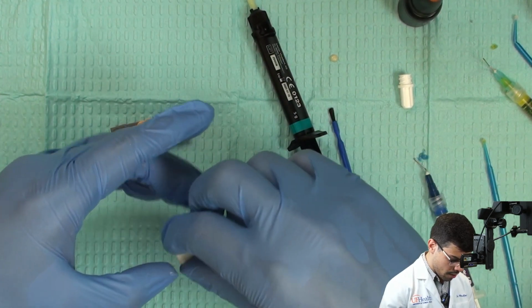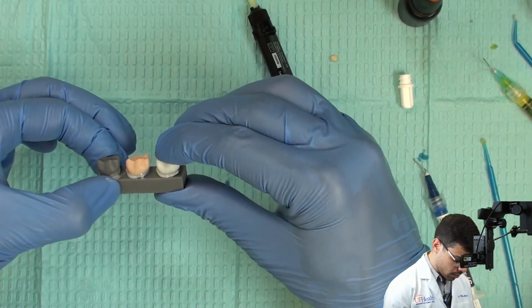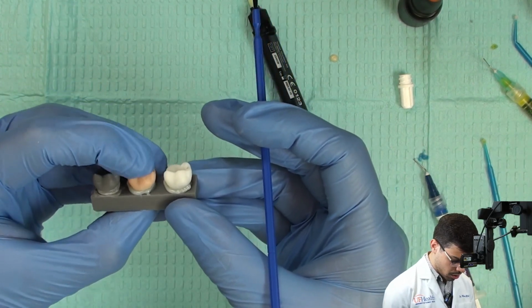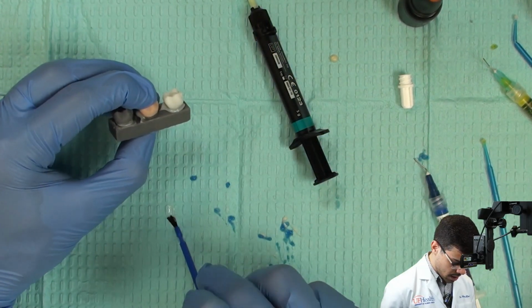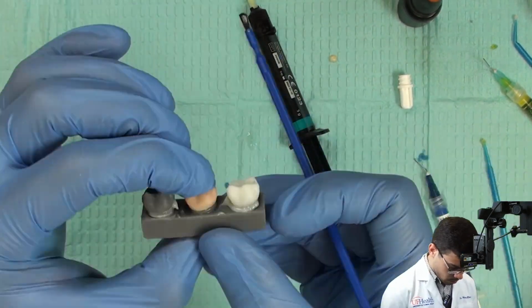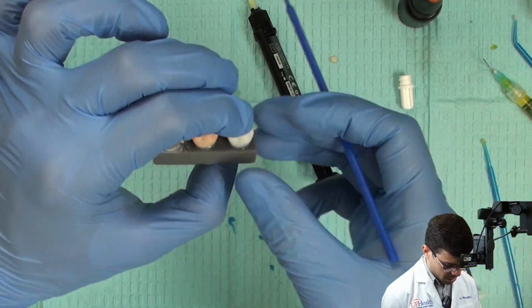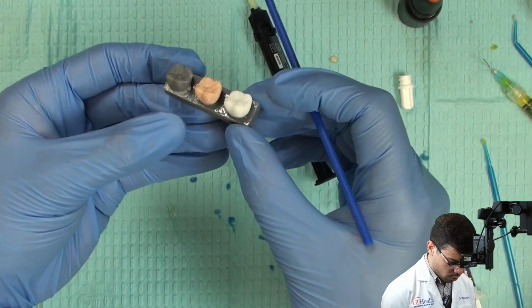So here I have the zirconia crown. I will press, okay? So now it's time for cleaning the excess of cement. I'm gonna use a Benda brush, so hold on the crown, then use the Benda brush to remove the excess of cement. All right, that's why rubber dam isolation in adhesion is pretty good because you see that I have excess of cement on the, in this case, gingival part.